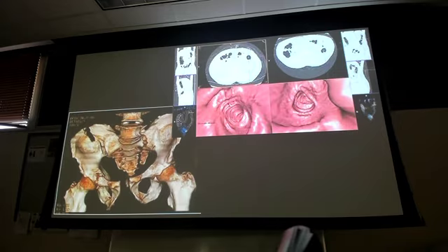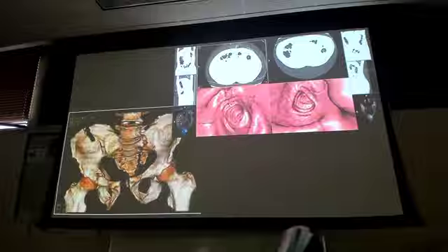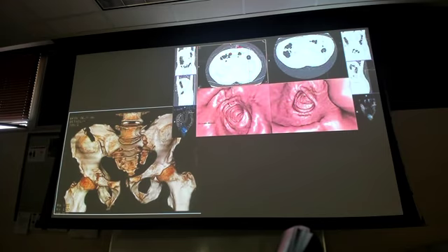They can now do virtual colonoscopies via CT and 3D imaging by just taking the scanner and pinpointing the area they want to look at. That's what these little crosshairs are. They're pinpointing the area they want to look at, and the machine can recalculate and give you this virtual view of the inside of the colon. It's not as good as a colonoscopy, but sometimes it's at least something, depending on what's going on.